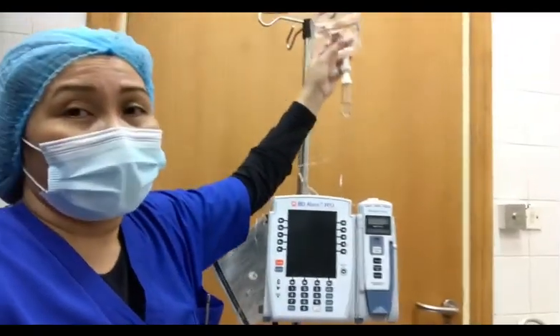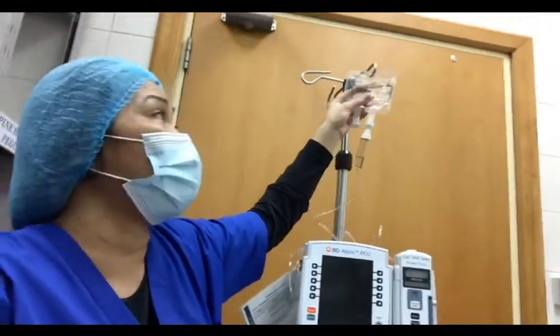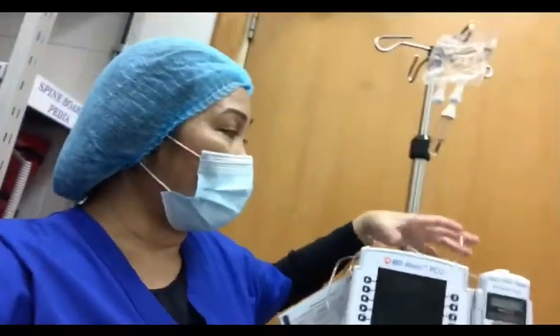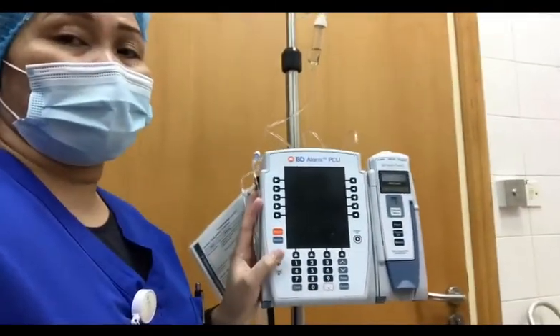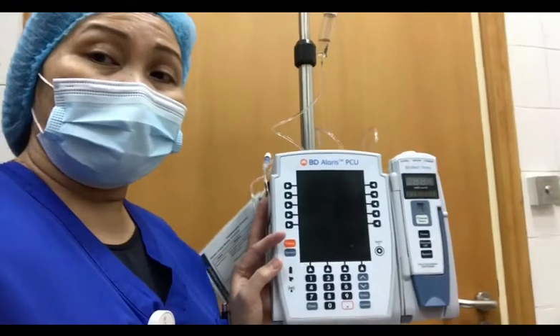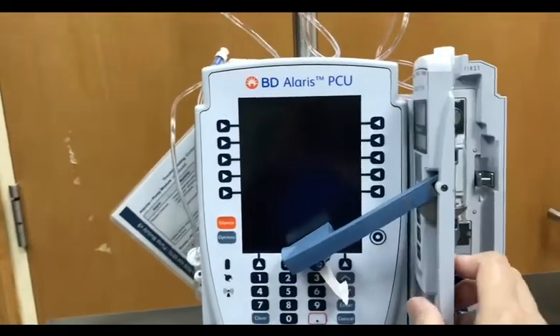First, prepare your IV fluid. Assuming that this is the 500cc normal saline, and prime at first. Then, after priming, we are now ready to set the machine. So, this is how to set the machine. So just open this clamp door, hook this one inside the machine.